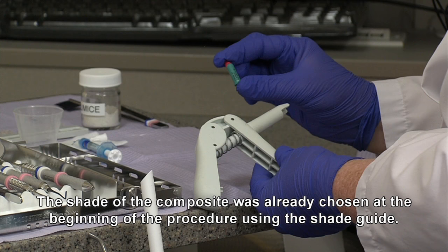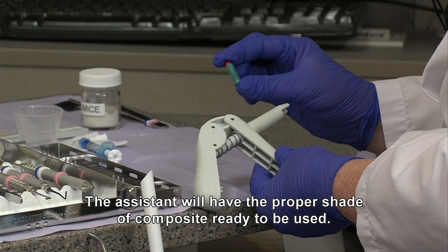The shade of the composite was already chosen at the beginning of the procedure using the shade guide. The assistant will have the proper shade of composite ready to be used.